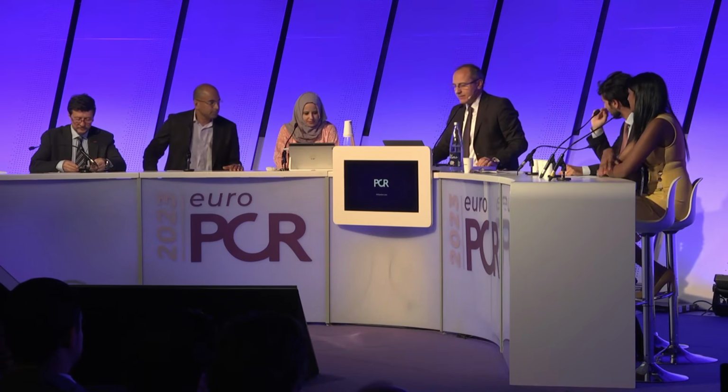Thank you very much, Ajay. So we see IVUS to be used to understand whether we need to modify the plaque and which kind of stent we have to implant and whether the stent is properly implanted. Let's go to the video. I think you're launching it from there.